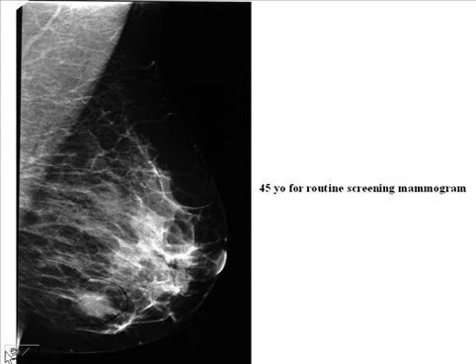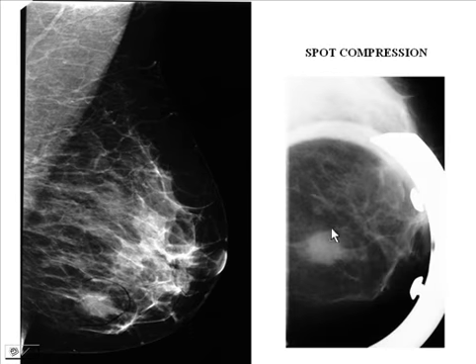Here are some examples of what we've just been talking about. Here's a 45-year-old woman for routine screening mammogram. And here you can see a region of asymmetry looking a little bit more mass-like than the remaining density in her breast. Conventionally, if you see an abnormality on a mammogram, you're going to start to work it up using the mammogram, and we did some spot compression views, which shows that this is a region of focal asymmetry. It doesn't show many characteristics about it, though.